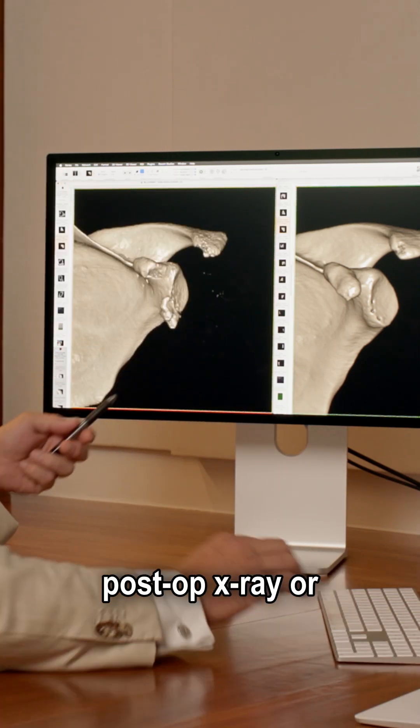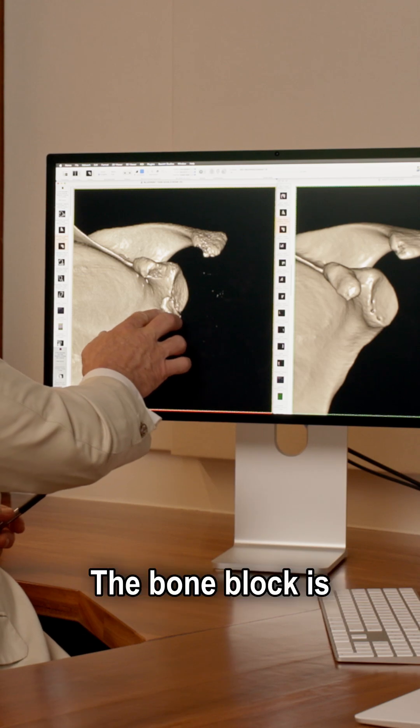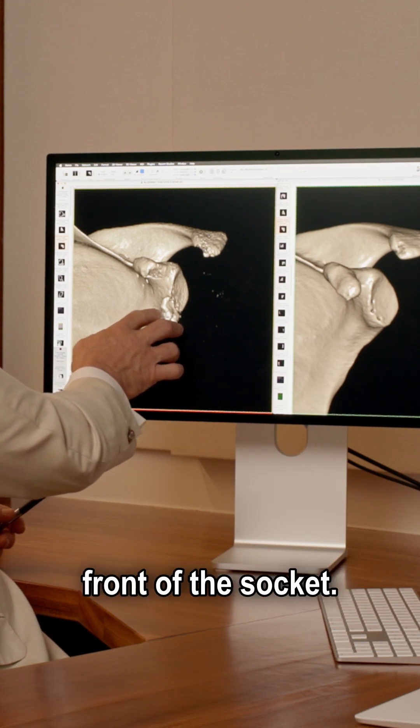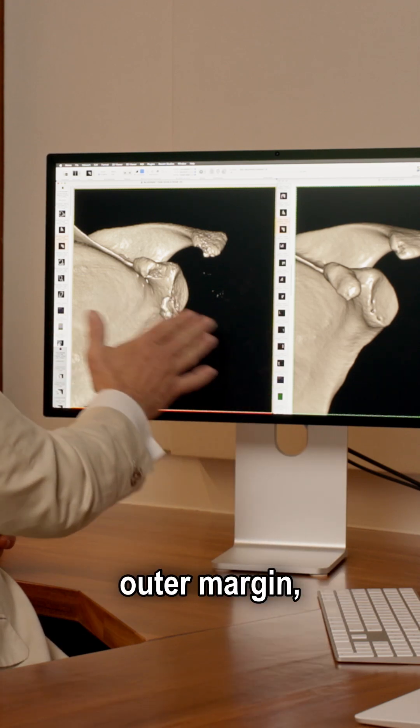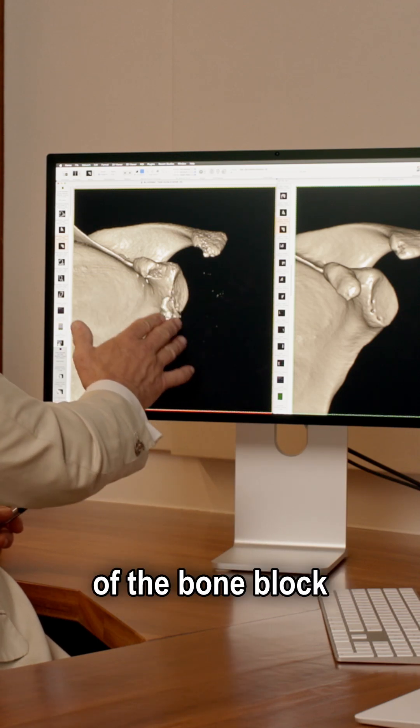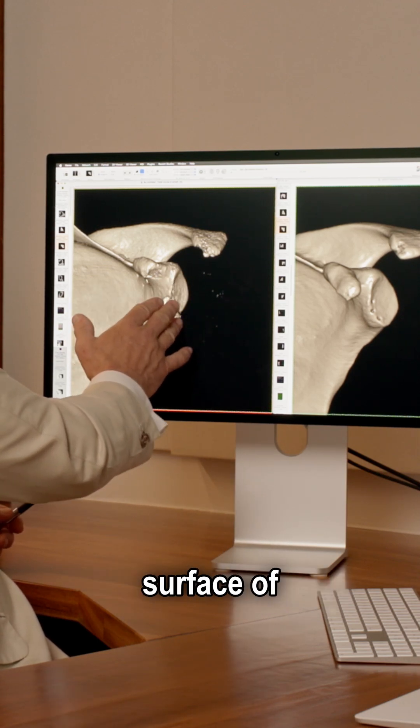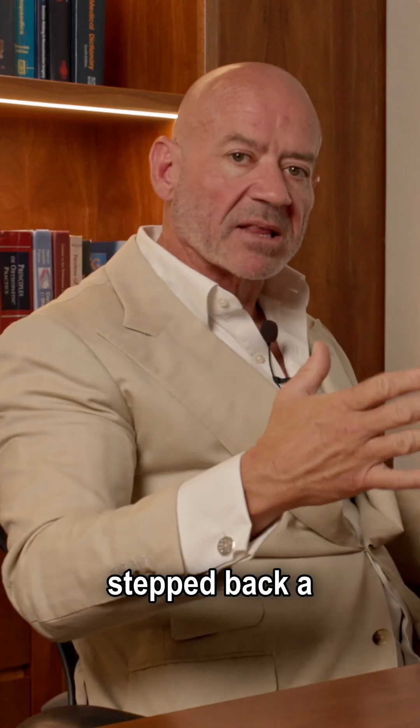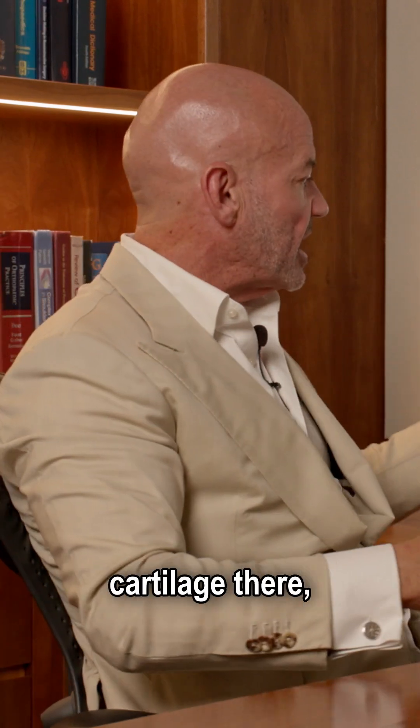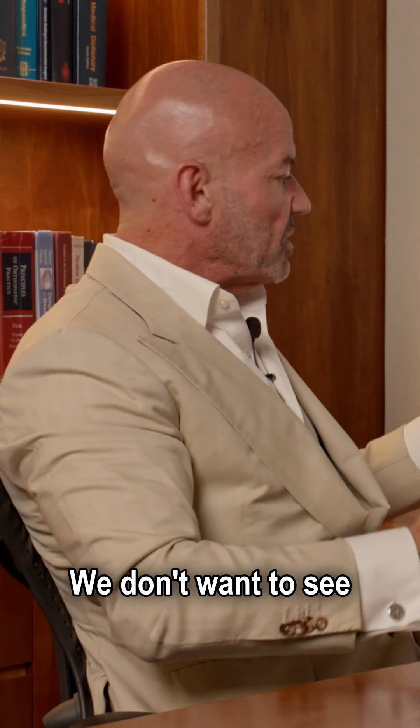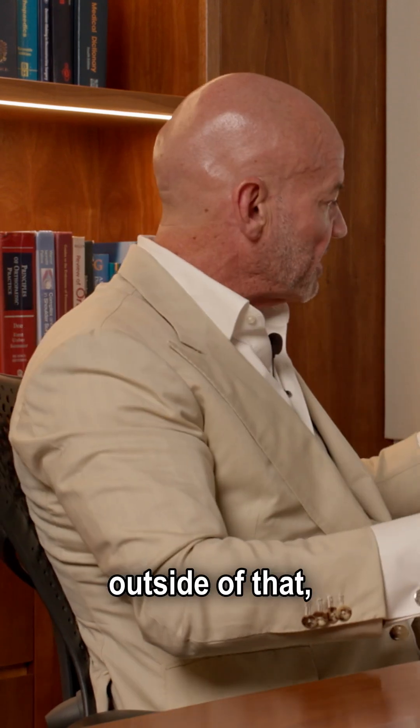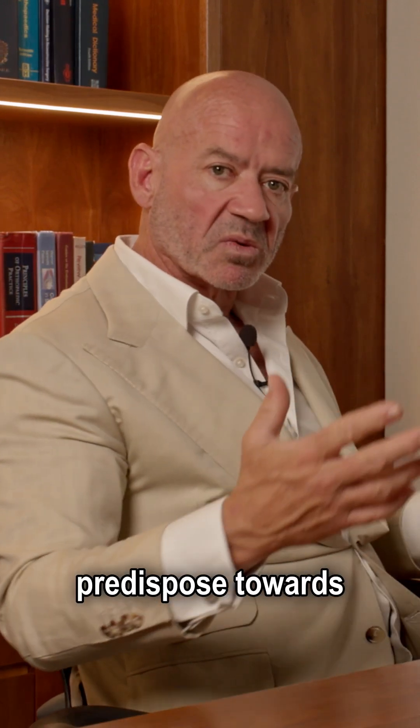This is the six-week post-op CT scan. The bone block is nice and low on the front of the socket. You can see that the outer margin, the lateral margin or the outside edge of the bone block, is level with the surface of the glenoid. That means it's stepped back a little bit because you have a layer of cartilage there, and that's exactly where we want to see it. We don't want to see it any further outside of that because that will predispose towards early arthritis.